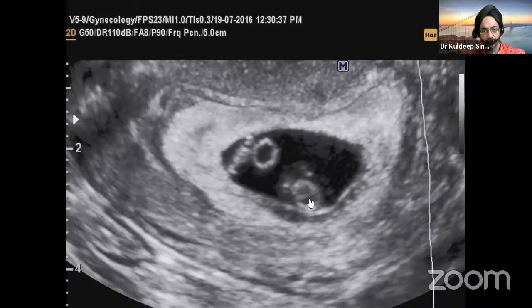How many embryos in that single gestational sac? So what type of a twin pregnancy would this finally turn out to be?